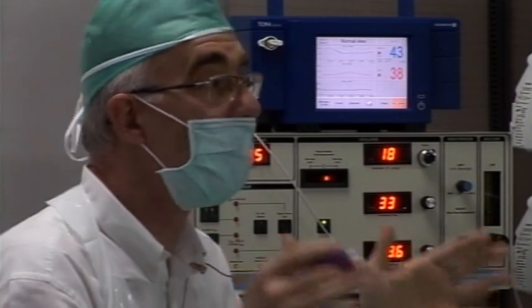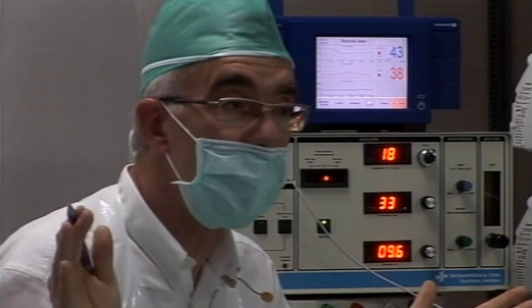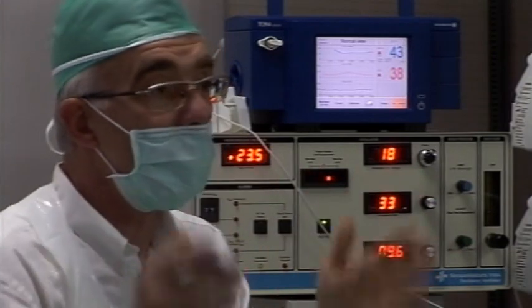It's a period of time where you like not to have a huge change of PCO2 and a huge change of PO2. That's a moment where you have to be there, or a well-trained nurse.